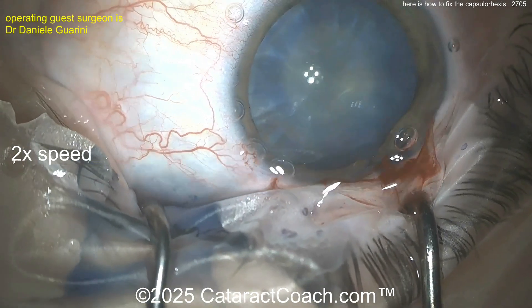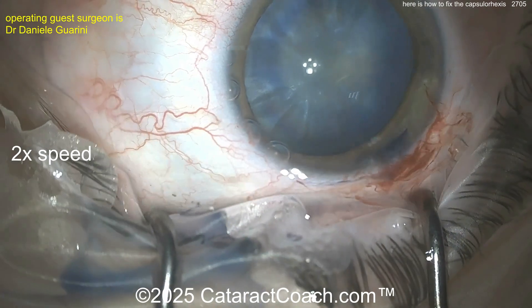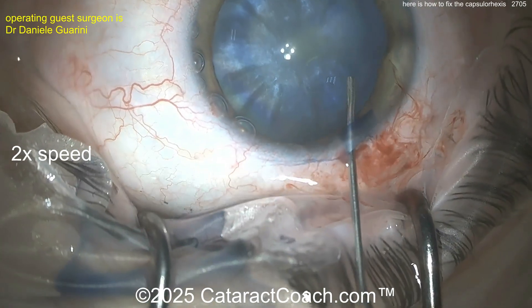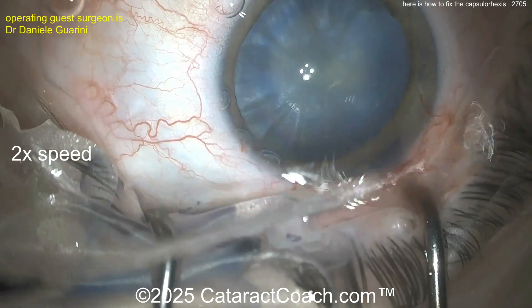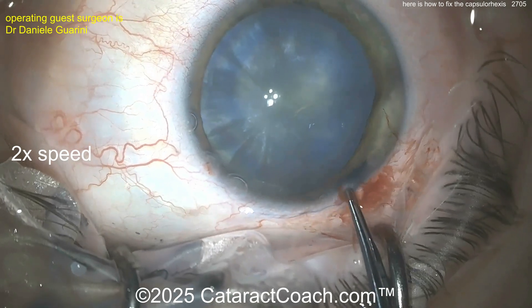We sped the video up here to 2x normal speed so we can be efficient, because we know how Cataract Coach fans like to get right to the point. Now the patient is moving around quite a bit — a little more viscoelastic going inside the eye. You may want to help fixate the eye with the side port, but let's see what we can get here with the rhexis.